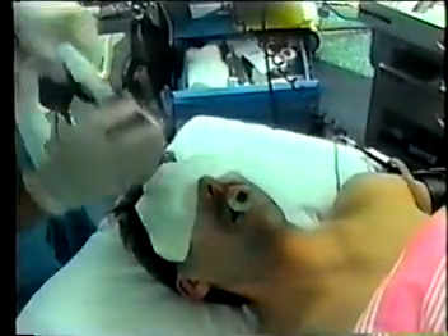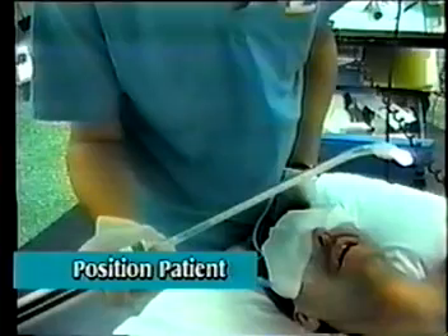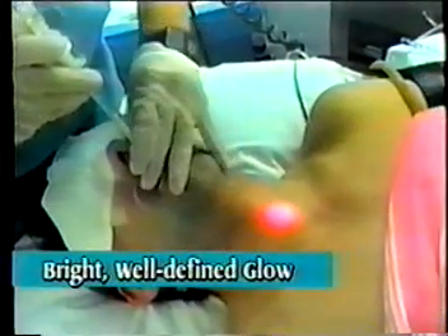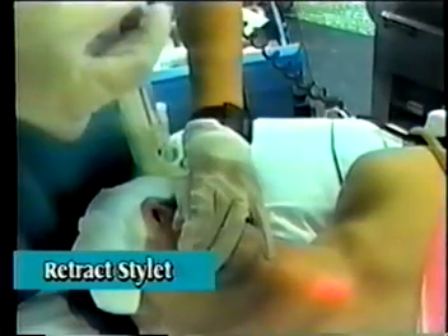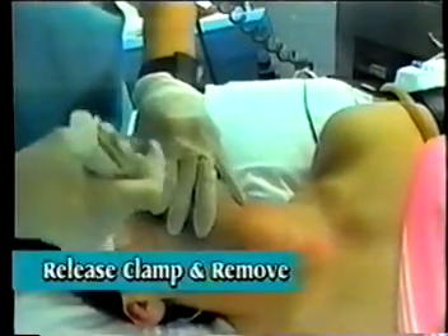Let's review what we've just seen, this time on a real patient. Establish a tight 90 degree bend. Unless contraindicated, position the patient. Lift the tongue and jaw. Advance the tube along the midline until the laryngeal prominence is seen to be illuminated. Gently advance the tip through the cords until you see the characteristic bright, well-defined glow. Retract the stylet approximately 10 centimeters. Advance the glow to the sternal notch. Release the clamp and remove the tracheal light, completing the intubation in typical fashion.